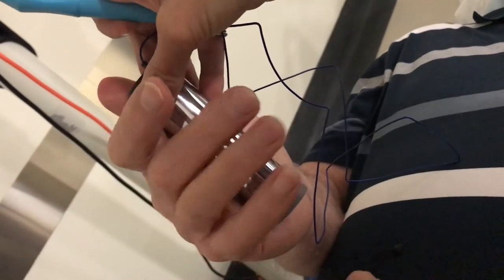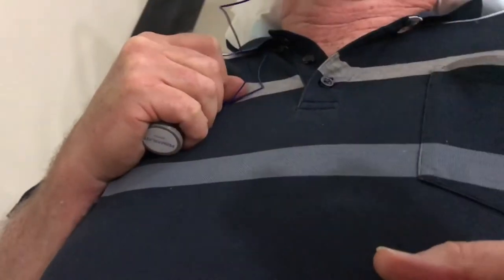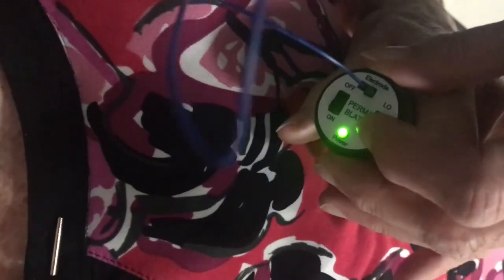The electrolysis process can be enhanced by moistening the hand used by the patient in holding the battery, thereby increasing electrical conductivity. Set the battery current strength on low.